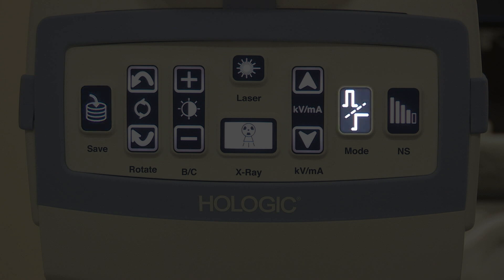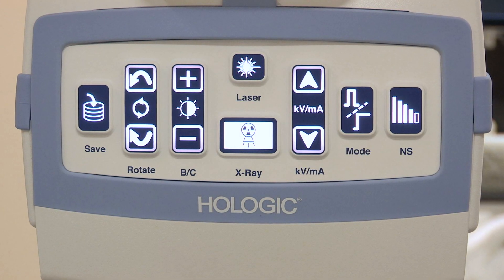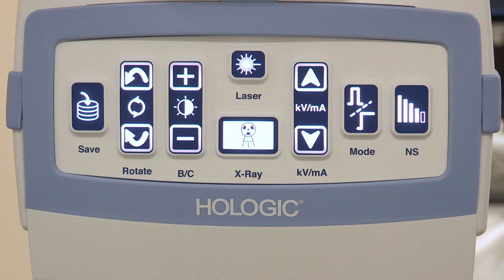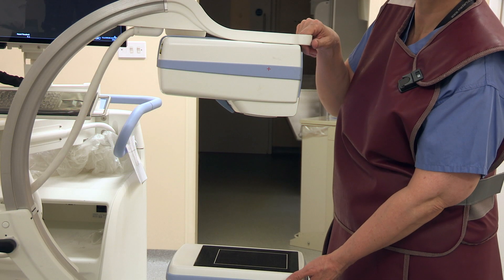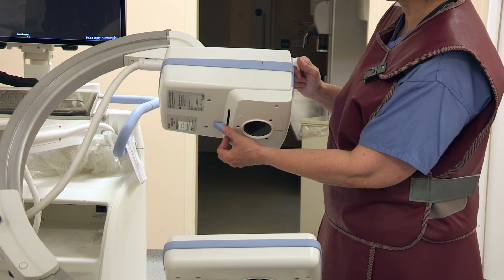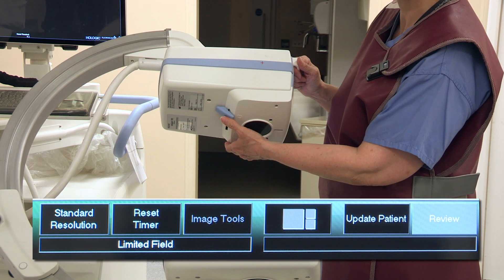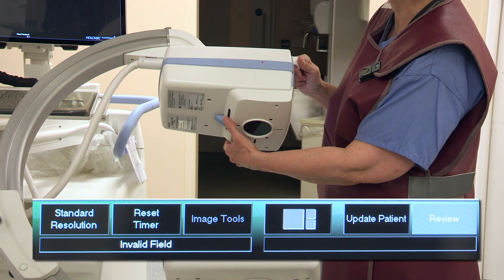This button is for taking videos. One push will give you a continuous burst, which isn't recorded. Two pushes will give you a cine film, which will record a short film as a loop. The remainder of the buttons control the energy of the X-rays and the quality of the image — the machine programming is so good that these buttons are best left well alone. Also on the X-ray generator is a lever which controls the X-ray field view: either a limited field or a full field. Ensure that the lever has been moved fully across into position.